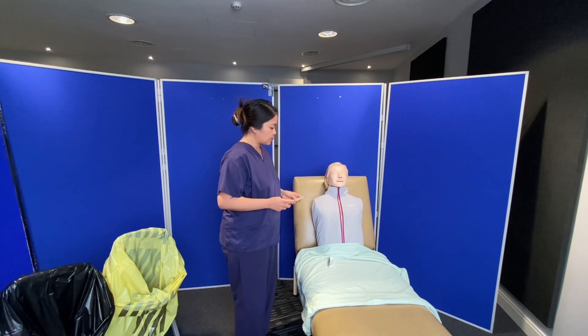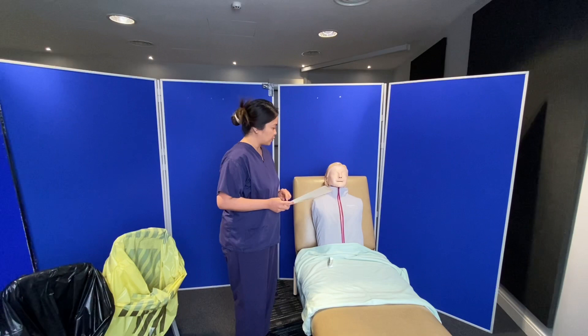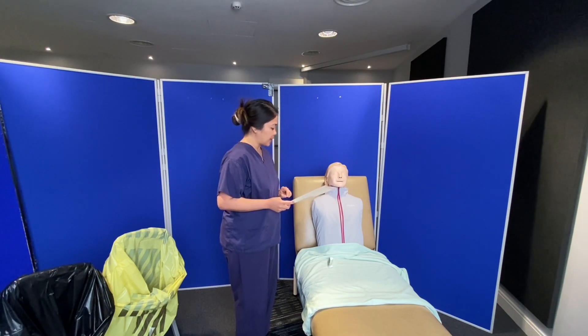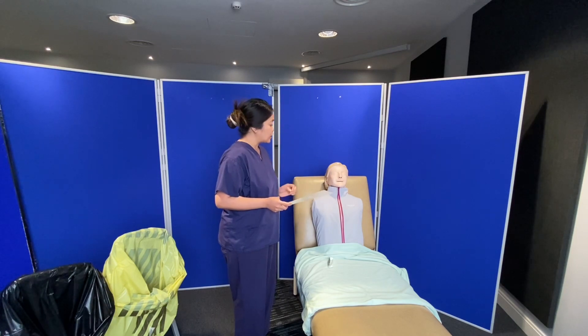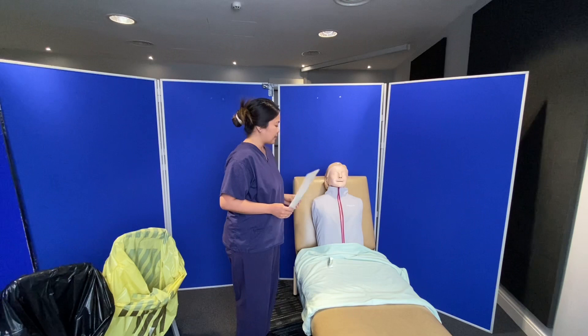So Jane, I'm here because I will be doing your wound dressing this morning. It says here that you have a surgical wound on the right side of your abdomen, and I need to clean it with 0.9% normal saline and apply a dressing. First, I need to check your wound site — is that okay with you? Yes, that's okay.